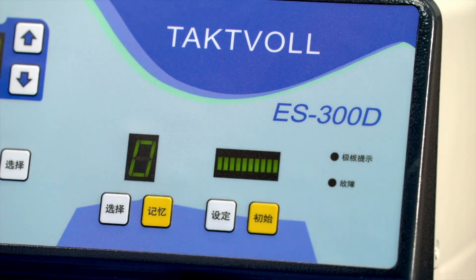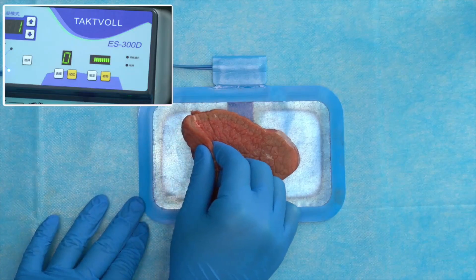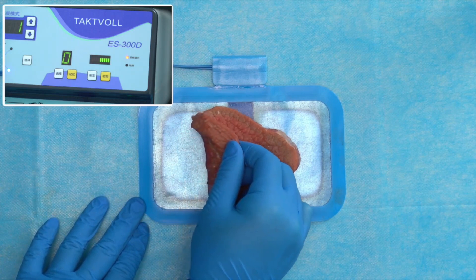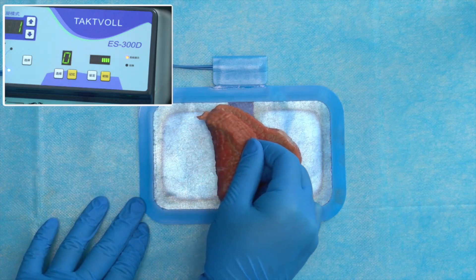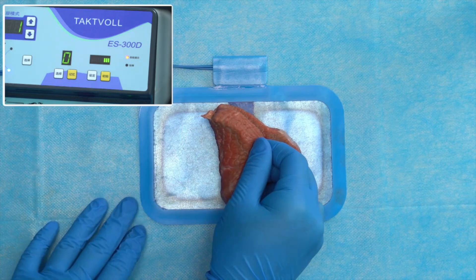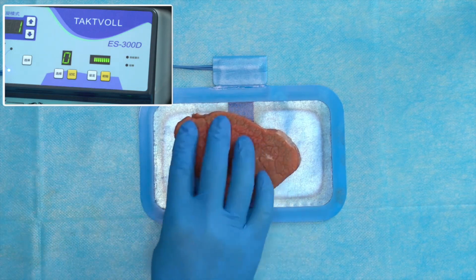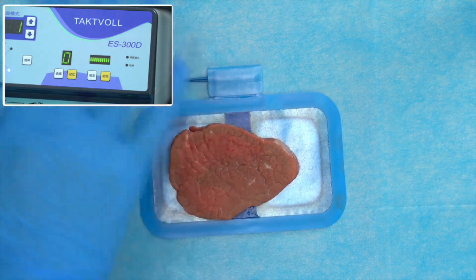The TactFall S300D has an integrated patient monitoring system which can automatically monitor the contact quality of the negative electrode and the patient in real time. The system can also be initialized according to different tissue impedances. If the connection quality is lower than the set value due to failure to fully fit the skin, the device will give an audible and visual alarm.